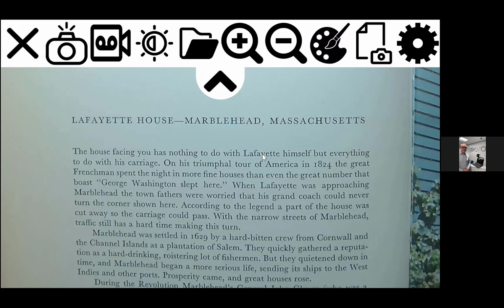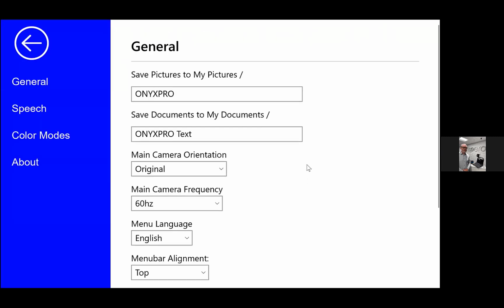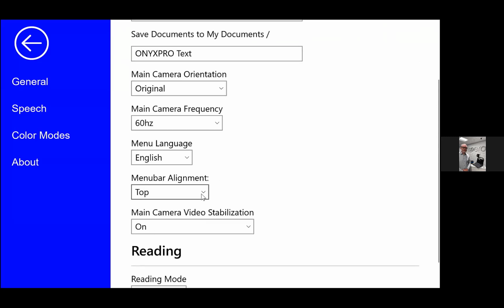So going from left to right, I could go over all those, but I'll wait until I show you what I like to do for a setup. So the first thing I did was go to your settings tab, which is the cog looking thing on the far right-hand side. In your settings, you've got some different options of where to save your documents. But the first thing I want to do is come down to menu bar alignment, and I want to change mine. You can change it from top to bottom or left to right. So I'm going to choose right.